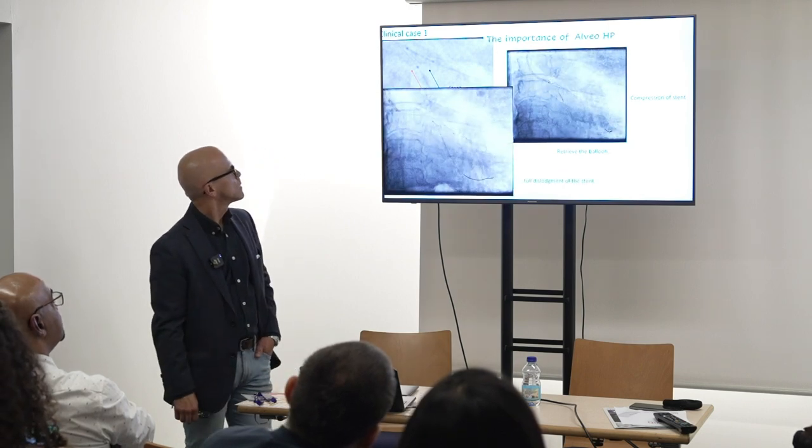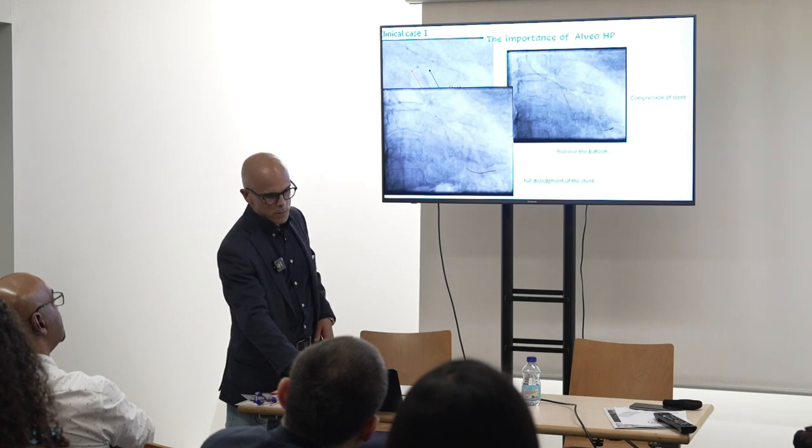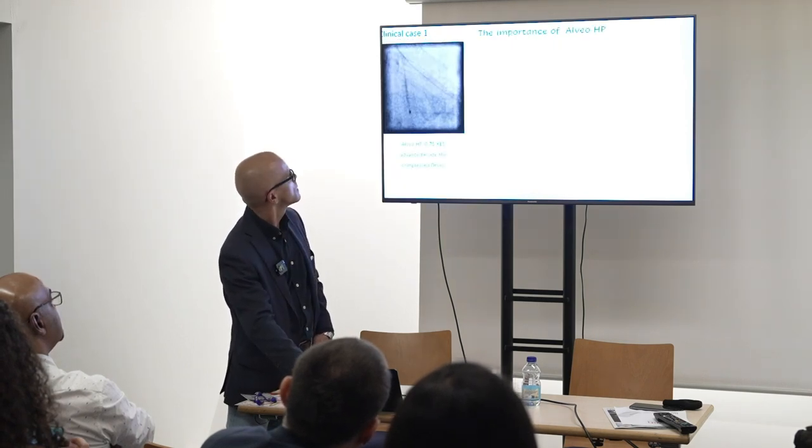So this is the balloon and that is the stent.